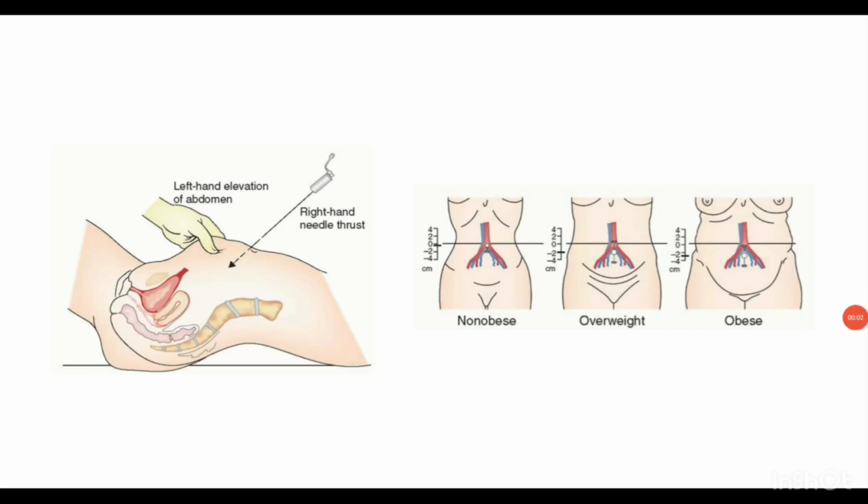We will discuss the remaining part, part 2 of laparoscopic umbilical port entry. Basically, the effects of obesity on umbilical entry. What are the effects of obesity on umbilical entry?